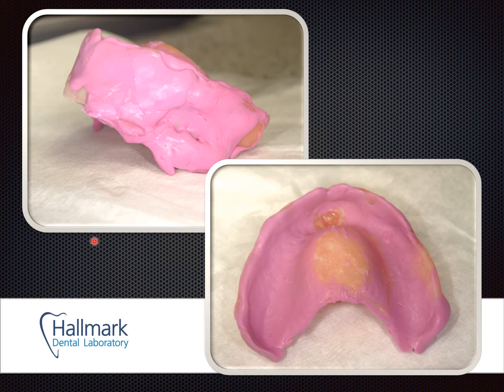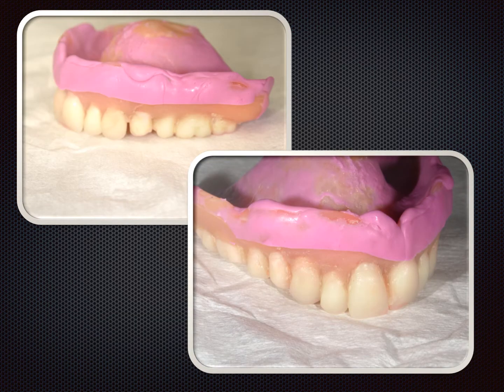When the denture is in place, have the patient bite firmly, holding it to their own occlusion, then gently border mold by grabbing the lip and in a slightly downward motion rolling it across to create the border roll. I applied the tray adhesive very liberally across the surface so it will stick everywhere. I'll clean that up a bit for the next step.